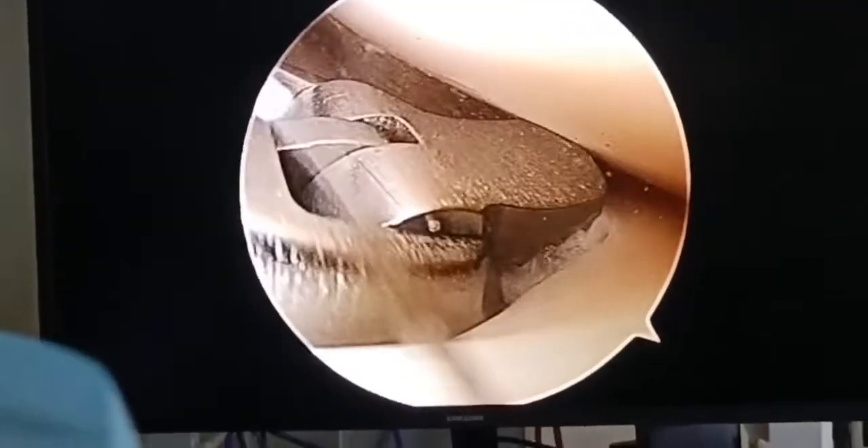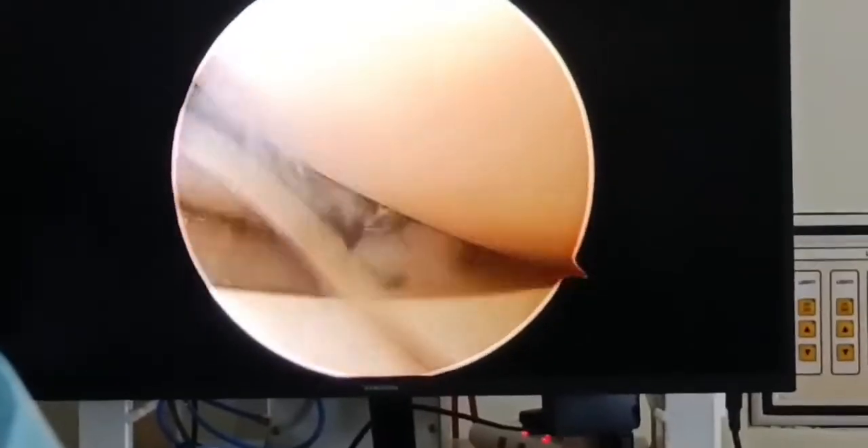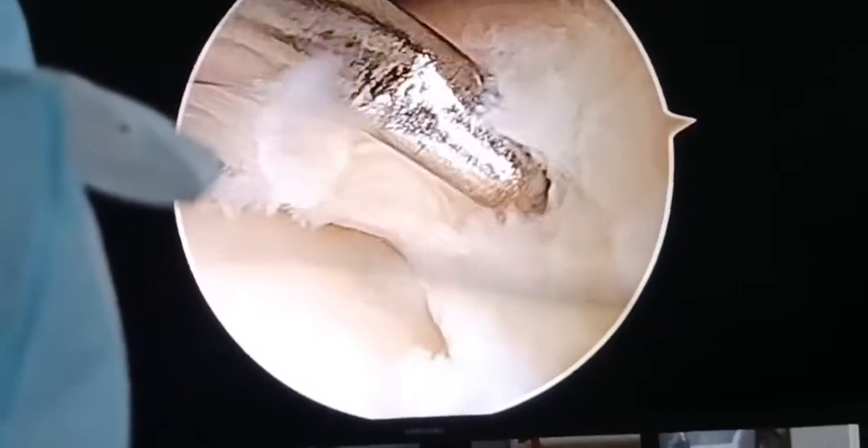We go ahead and do a partial meniscectomy and smoothen the edges; it will also allow us to gain access from the tear area from where the cyst has formed. We use the shaver as well as the meniscus basket to smoothen out the edges and perform a partial meniscectomy.